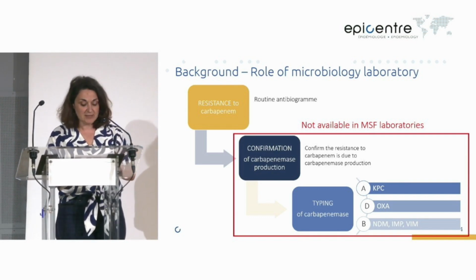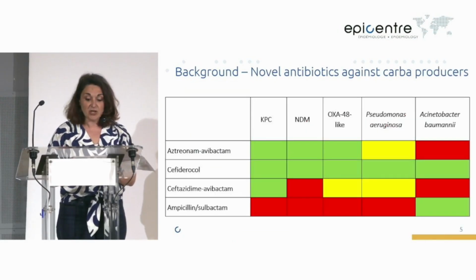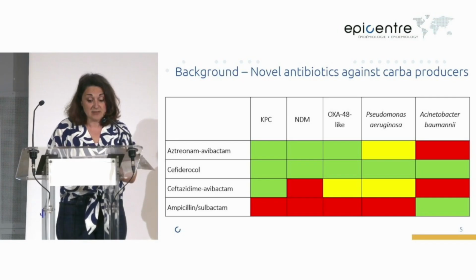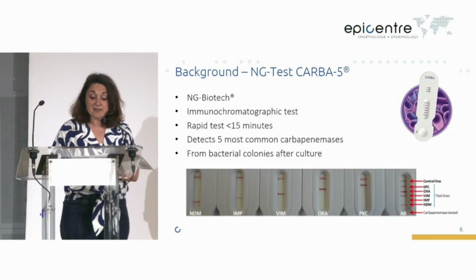These methods for typing, phenotyping or molecular identification are not available in MSF settings. And this is very important because the type of CPE identified conditions the type of treatment. So it's very important for the lab to be able to identify the class in question.